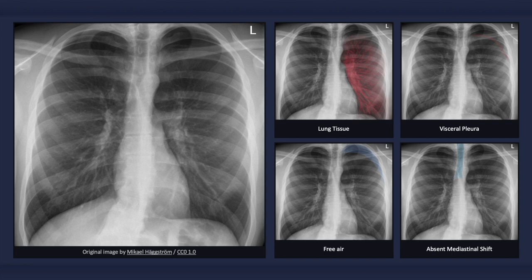Supine X-rays lack sensitivity for detecting pneumothorax and should not be relied upon if negative. If the patient cannot stand, then a lateral decubitus X-ray should be taken with the affected lung facing upwards.